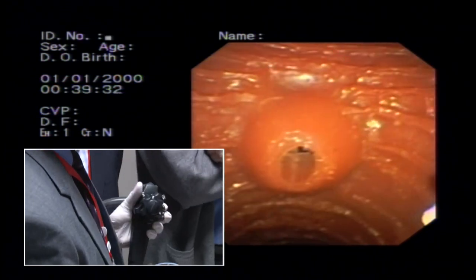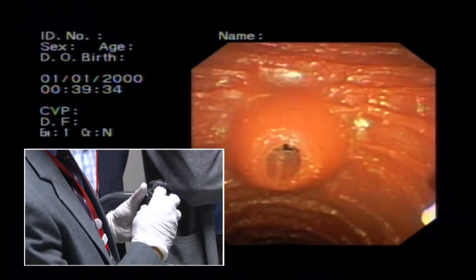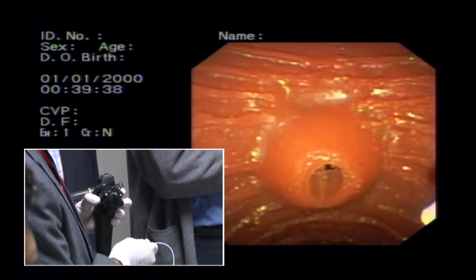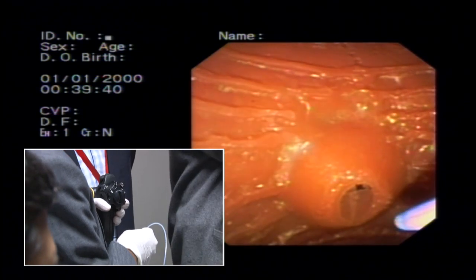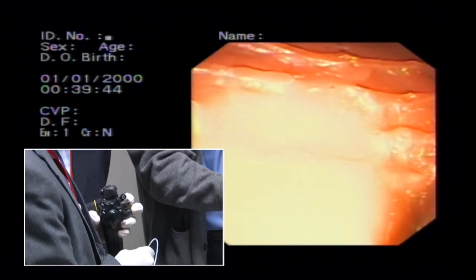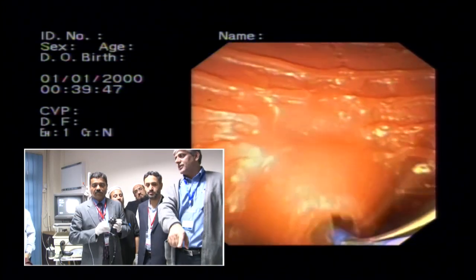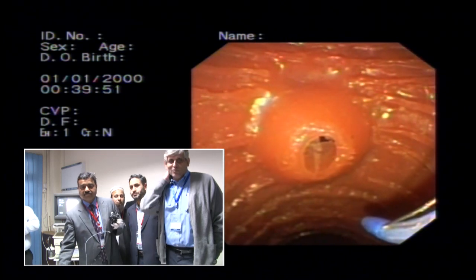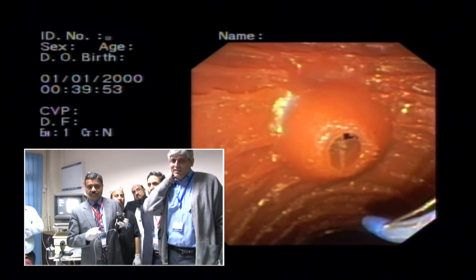you when we do it in the live session, because you will probably understand it better. If it's a very easy open thing, put the cannula, it went in a little, push the wire. You don't have to do anything. You just need to make sure that you're in position. This position is very important because nowadays we don't do diagnostic here. So almost always you'll end up doing something.